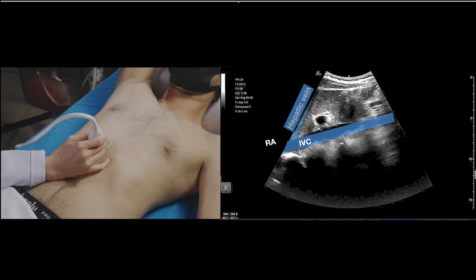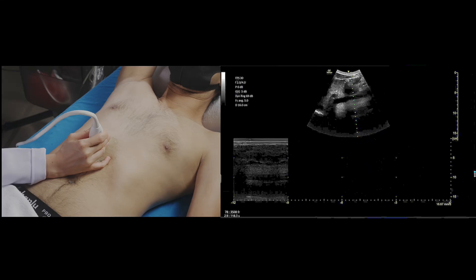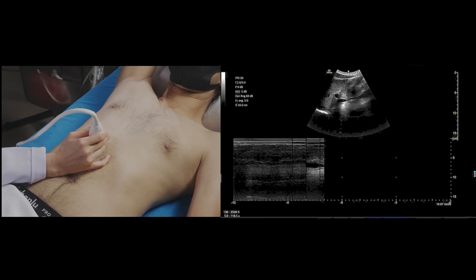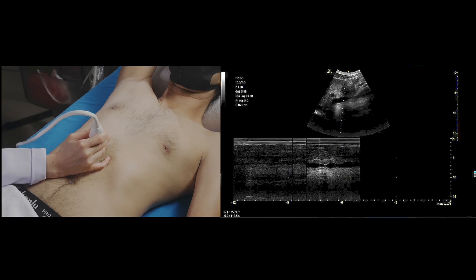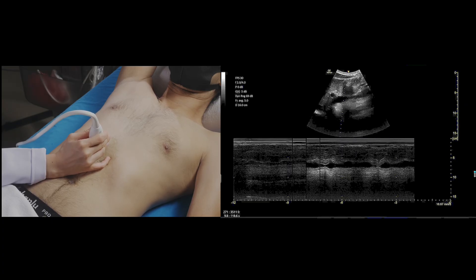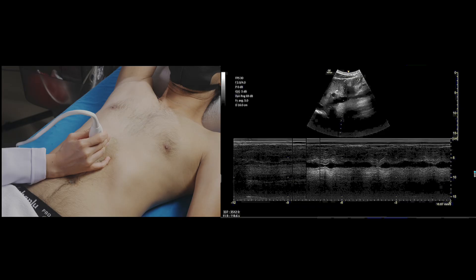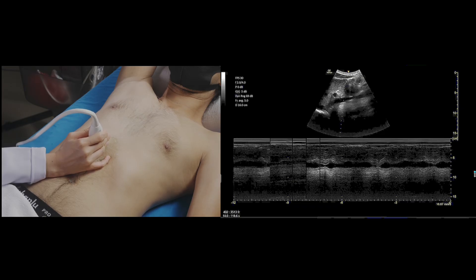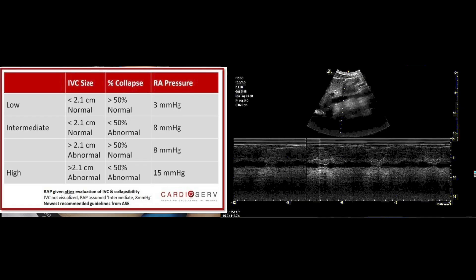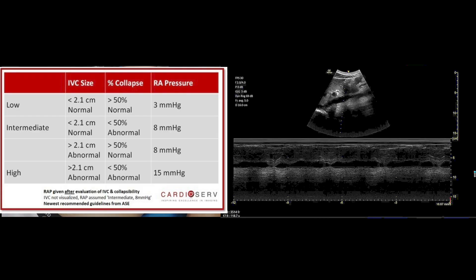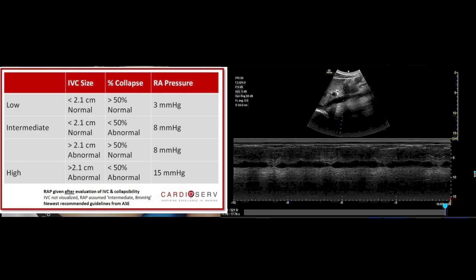You can measure the IVC diameter using B-mode, but some may be more familiar using M-mode to obtain the collapsibility and distensibility index. In VEXUS, an IVC maximal size of less than or equal to 2 cm corresponds to VEXUS grade 0. However, in the Asian population, a lower threshold might be necessary. If using standard VEXUS technique and IVC measures more than 2 cm, we proceed to the next step.